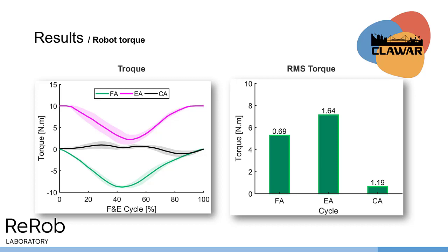Subsequently, during flexion, the exoskeleton applied torque to help restore the extended position. At this point, the user perceived this torque as resistance to his movements. In the completely assisted mode, the exoskeleton applied minimal torque, primarily aiming to correct reference tracking errors.